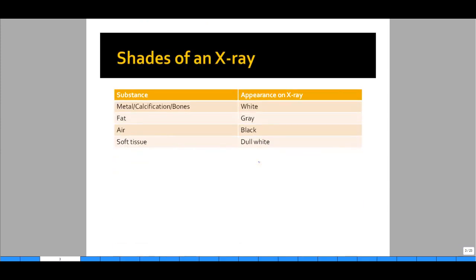Getting to the shades of an x-ray, the table here demonstrates the different tissues and objects that can be present on a chest x-ray and how they look. Metals, calcifications, and bones appear white. Metals appear very bright white, as well as calcifications. Bones tend to be more of a dull white. Any time you see white on a chest x-ray, it's usually one of these three. An example of a calcification would be aortic calcifications, commonly seen in patients with coronary artery disease — there will be calcifications present in the aortic knob.